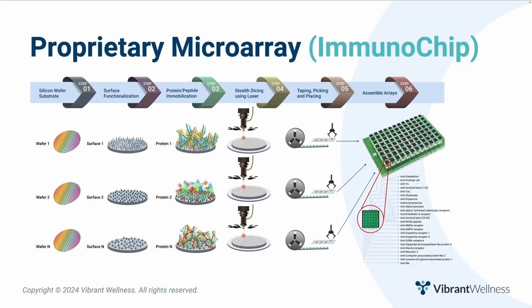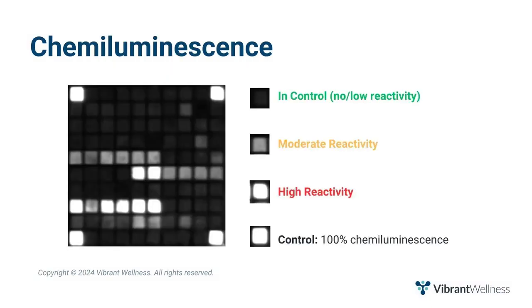Then arrange the microchips, one for each antigen, in a 4x4 or 10x10 grid atop one pillar on a 96 or 24 pillar plate. The pillar plate is then submerged into the patient blood sample, allowing for the simultaneous analysis of a large number of analytes from a single sample.